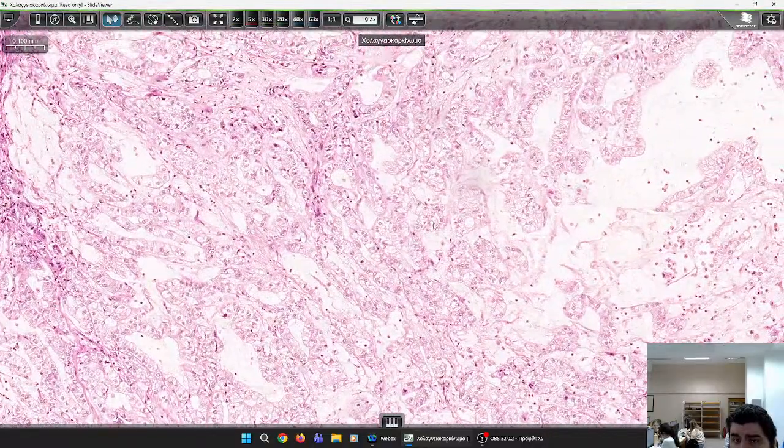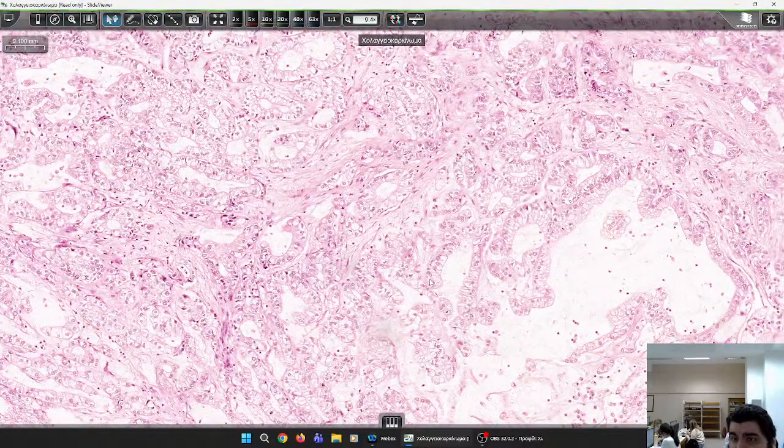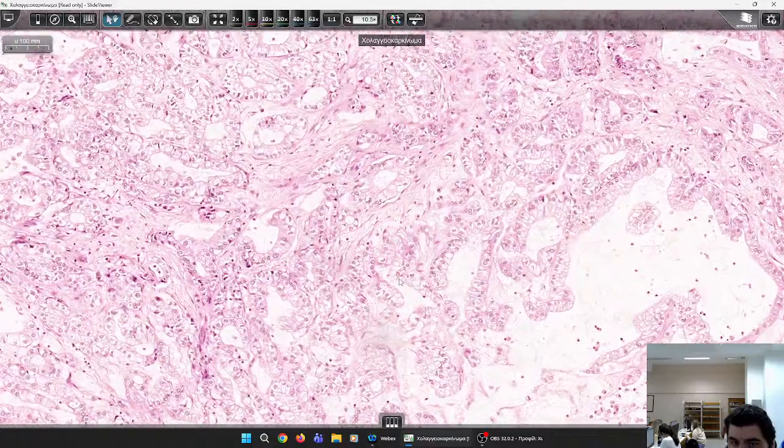Bile is produced by hepatocytes, but it is transmitted through cholangiocytes. This is not functional. So macroscopically, what would you expect to be green in color? Hepatocellular carcinoma, HCC, or cholangiocarcinoma? The one that produces the bile. So the hepatocellular carcinoma is the one that you expect to be green in color.